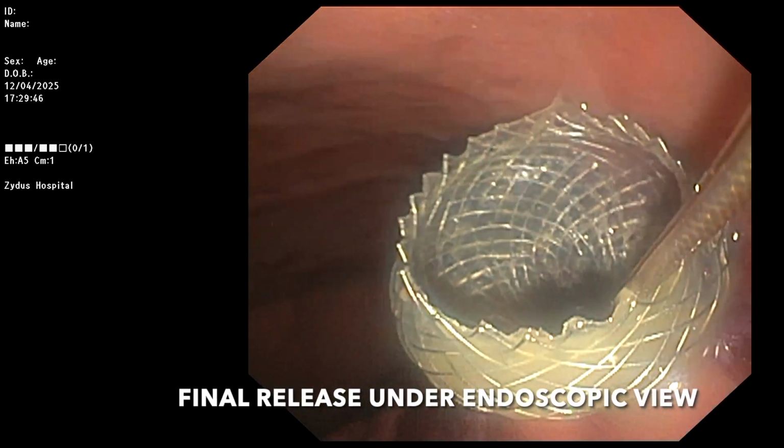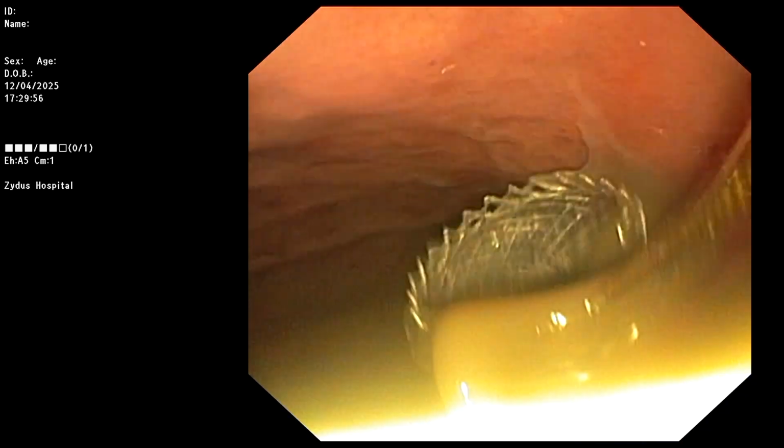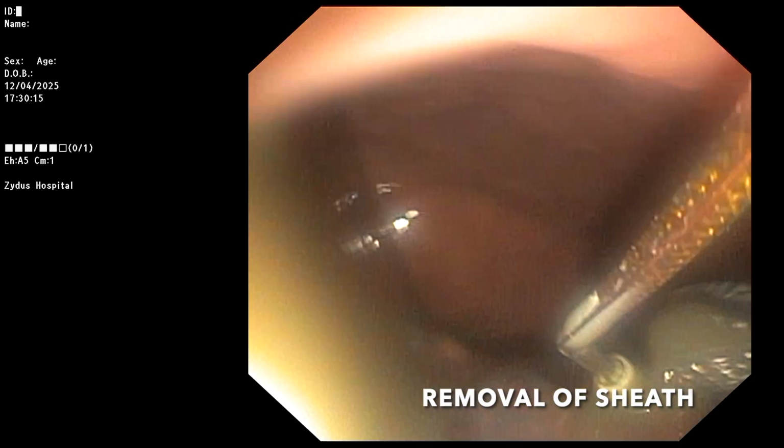So this is a final release which we can see even on the endoscopic as well as fluoroscopic view. You hold the sheath, otherwise you can displace the stent from its position, and as you can see the whole gush of pus which has come out in the stomach.